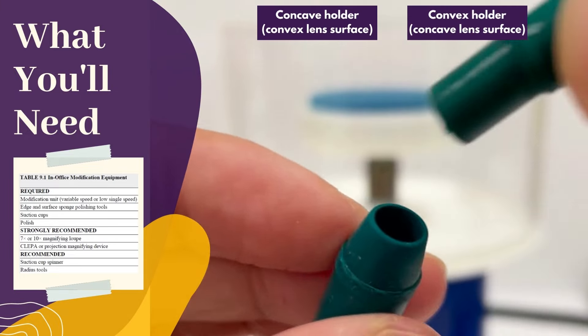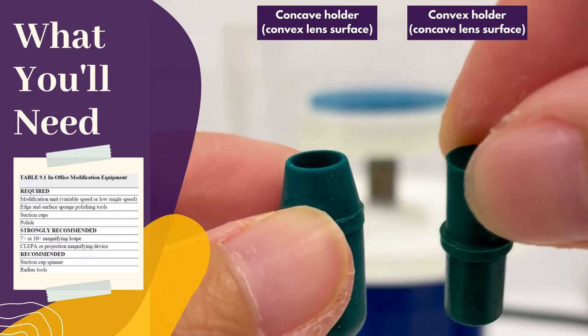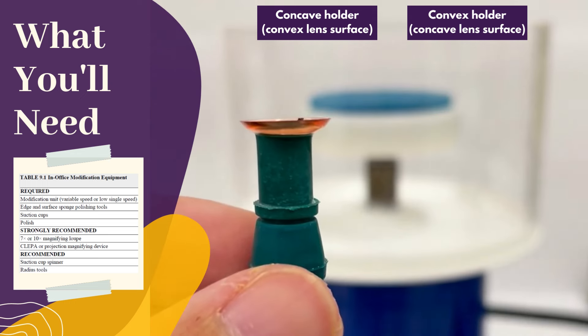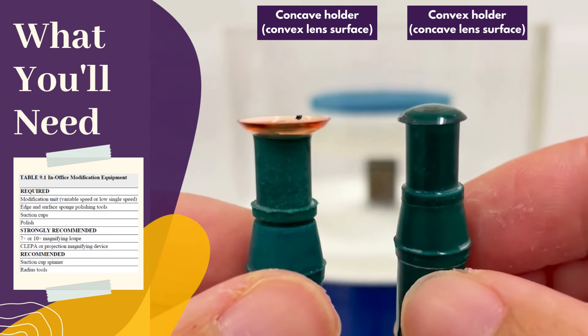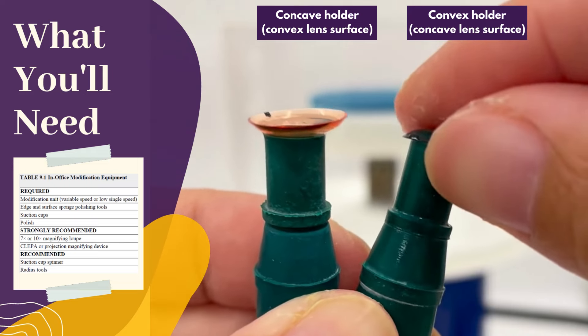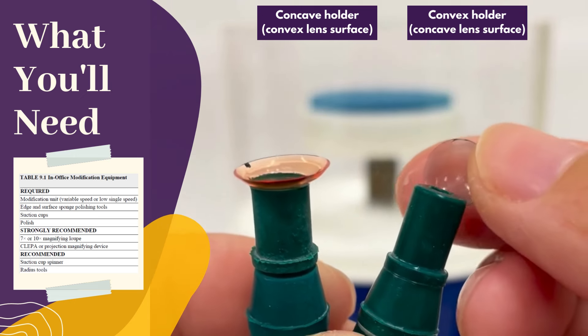The greenies come with a two-sided holder. Use the concave side to attach the front convex lens surface, and the convex side to attach the back concave lens surface. Start with wet greenies and lenses to improve suction. Polish also dries out your hands, so please excuse my dry skin.